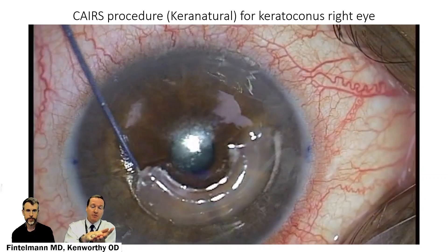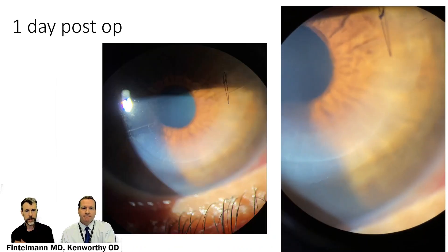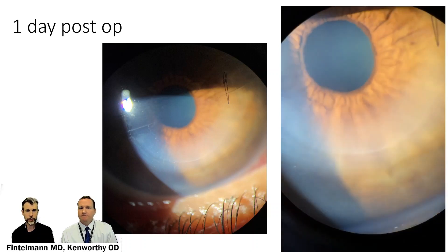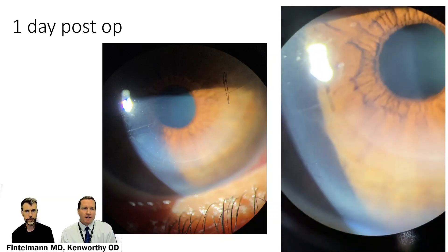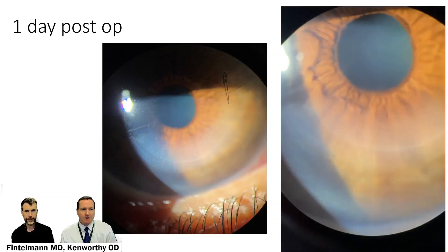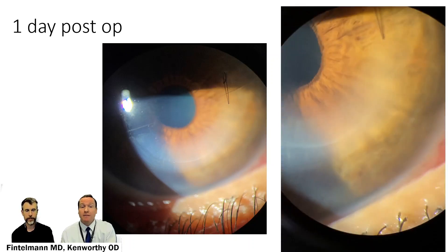This is much more superficial and anterior in the cornea, and thus it has more of an effect. The more anterior things are, the more they push on the cornea. Intacs are made out of PMMA, which is a very stiff plastic — basically plexiglass — and so there were some issues with scarring and melting around the implant. The KeraNatural, as you can see here at one day post-op, is pretty well accepted and not as visible as Intacs would be. That's a nice one-day post-op view just scanning across the cornea.